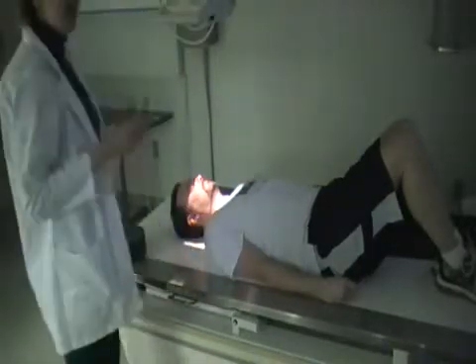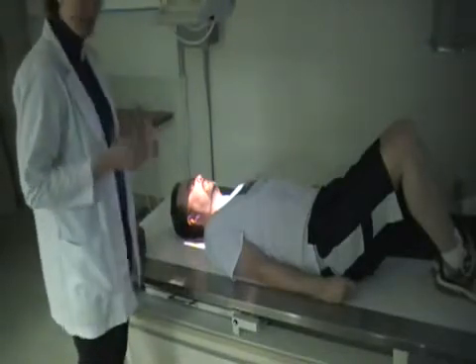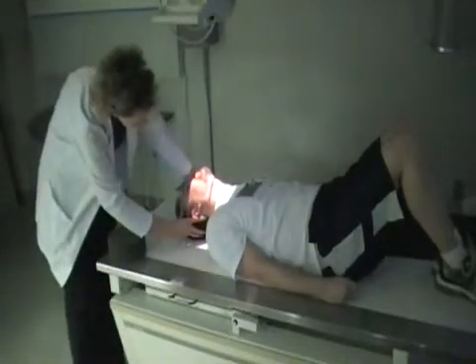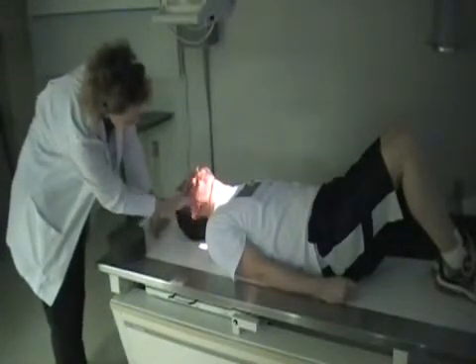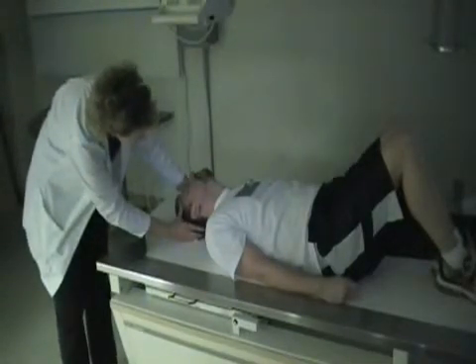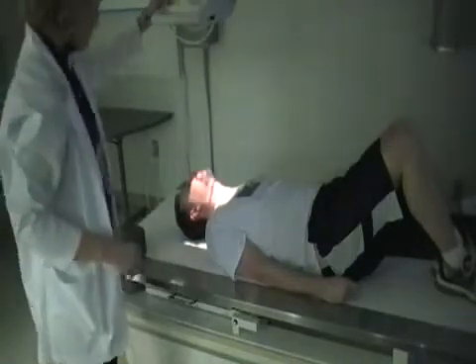And again, you can only do this if the patient does not have any neck injuries, because with this you're going to extend the head way back. So I'm going to have David move his chin way back, because this border of the mandible is going to be going straight up and down perpendicular to the table. So I'm going to bring it down just a tad. There you go, because you want this border to be going straight, intersecting perpendicular.